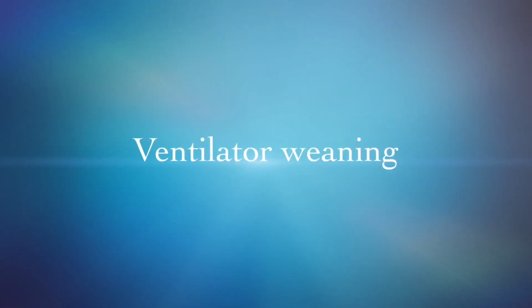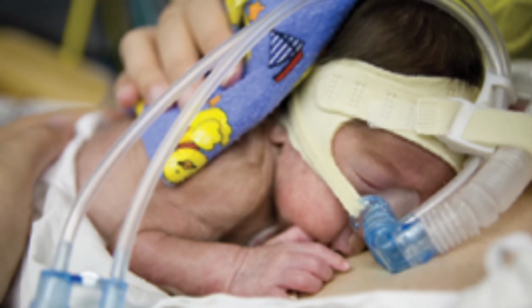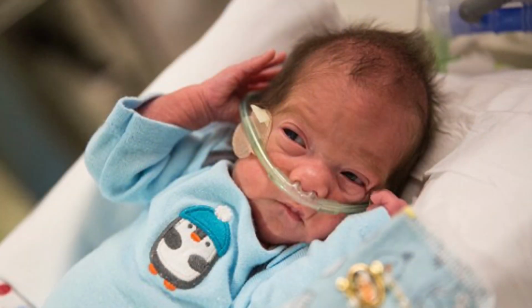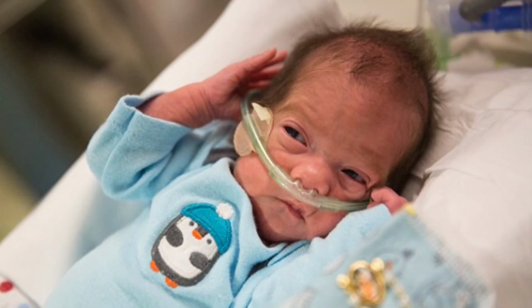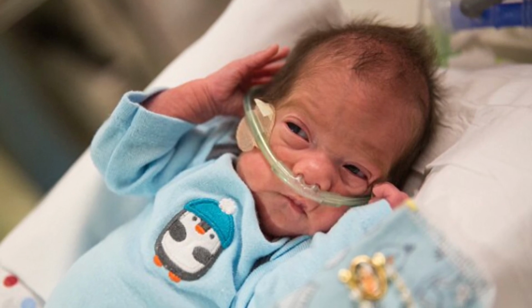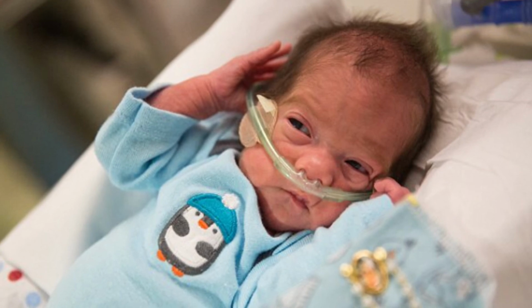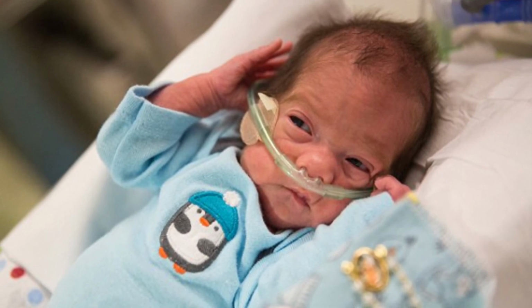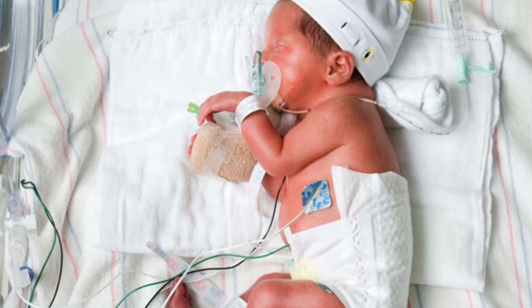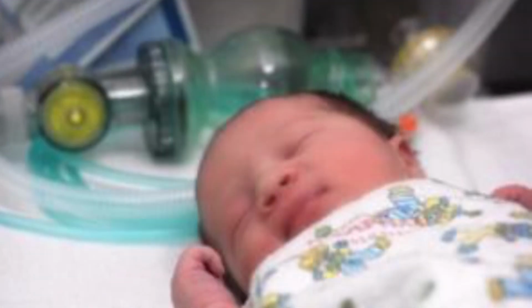Ventilator weaning and extubation. Gradually decrease supplemental oxygen according to patient condition. The patient should be stable for at least 24 hours with no inotropic support, stable in oxygenation and ventilation with stable blood gas and X-ray, and noted with spontaneous breathing. Feeding must be withheld at least 4 hours before extubation to avoid aspiration.